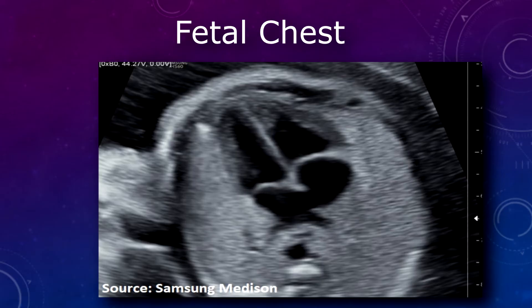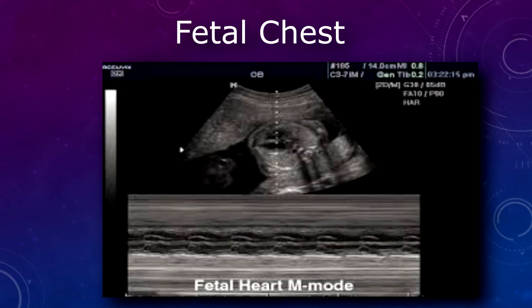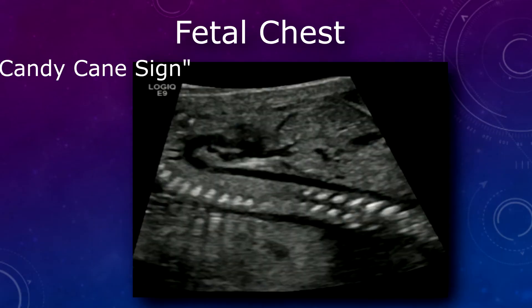Next, you may go to the fetal heart and get the very famous four-chamber view, which shows both ventricles and atria. The fetal heart usually lies at approximately a 45-degree angle in the chest to the left. A transverse view will show the two lungs, spine, and the heart with its angle to the left. It is sometimes normal to see a tiny bit of pericardial fluid, usually under 2 millimeters. At the four-chamber level, you may rule out ventricular septal defect or atrial septal defect. You may apply M-mode at this level to get the fetal heart rate and rule out fetal tachycardia or arrhythmia. If you go sagittal at the fetal heart, you can also see the aortic arch.